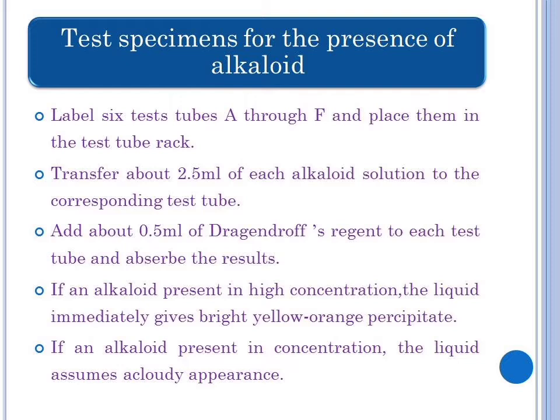Analyze the alkaloids using paper chromatography. Dragendorff reagent is a good precipitation reagent for alkaloid testing. But precipitation tests tell us nothing about the identity of the alkaloid. In this procedure, we use paper chromatography to produce chromatograms of known alkaloids. Visualize this chromatogram with Dragendorff reagent and determine the Rf value for each alkaloid.